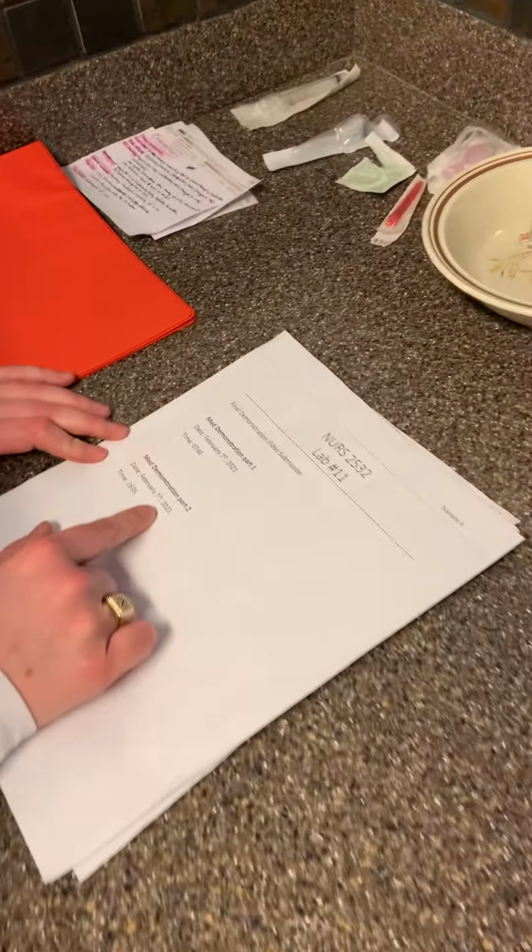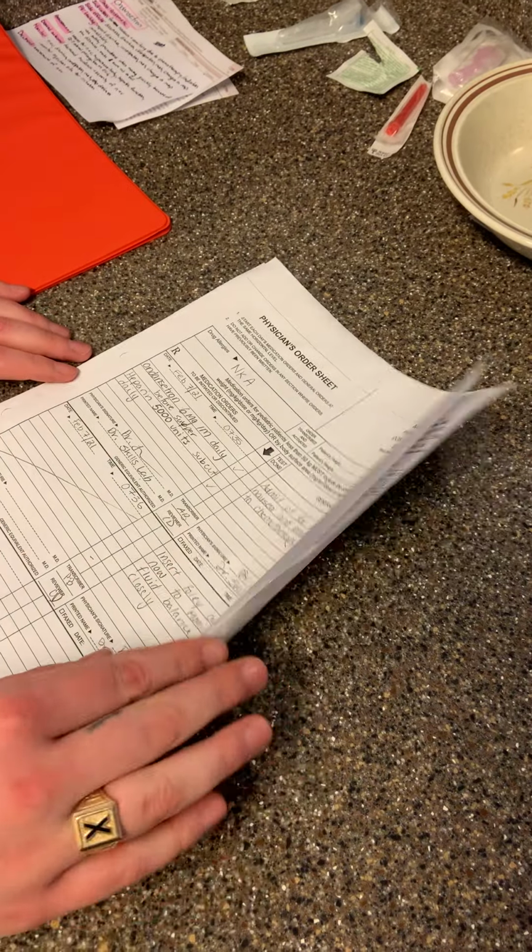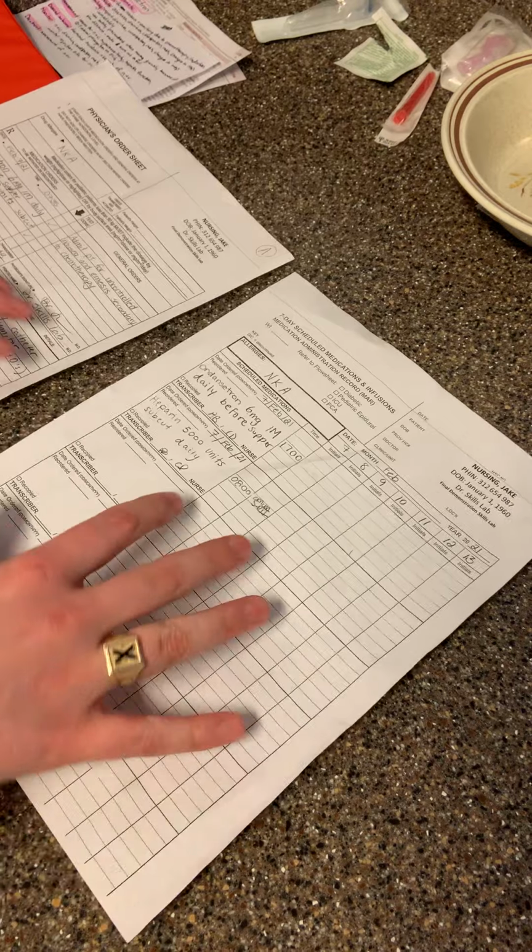Treating Marchischuk, doing an IM injection. So it's February 7th, 2021 at 16:35. So we'll compare the physician's orders to the MAR.